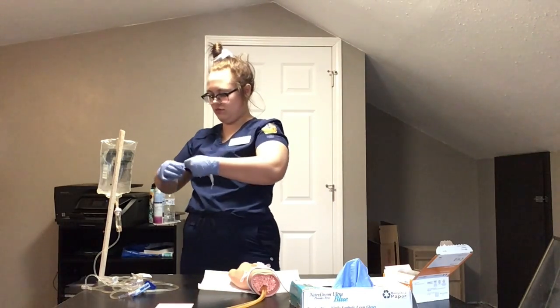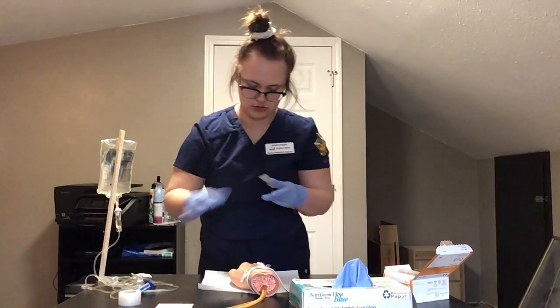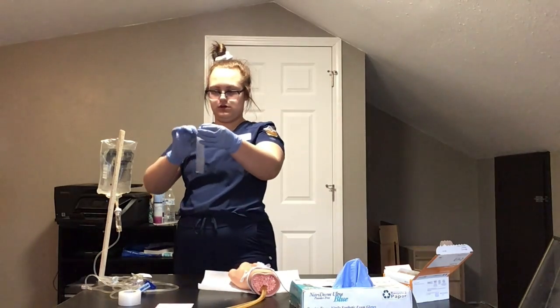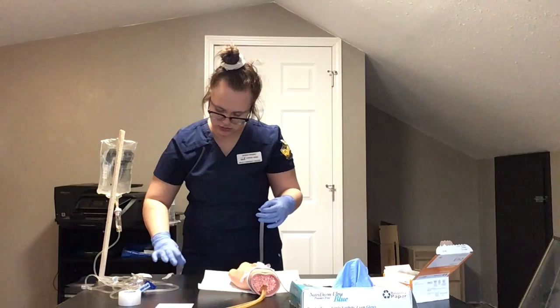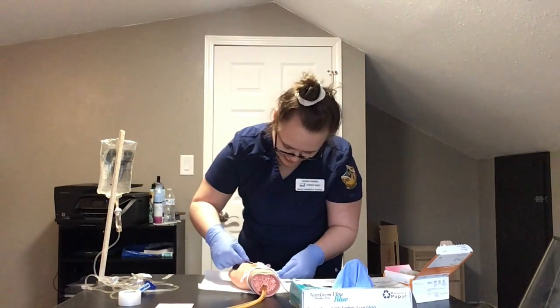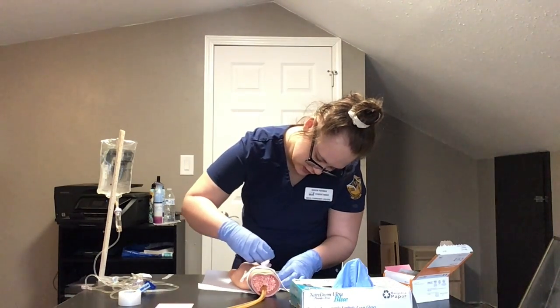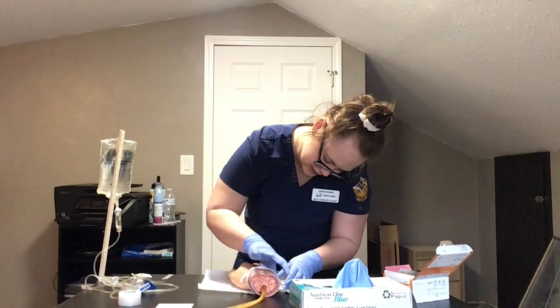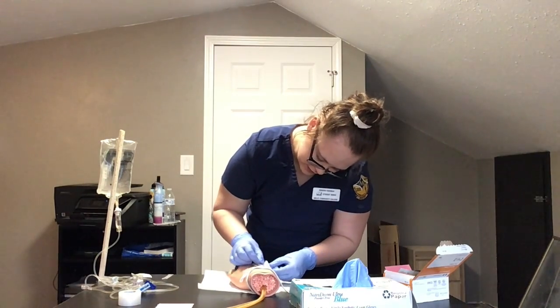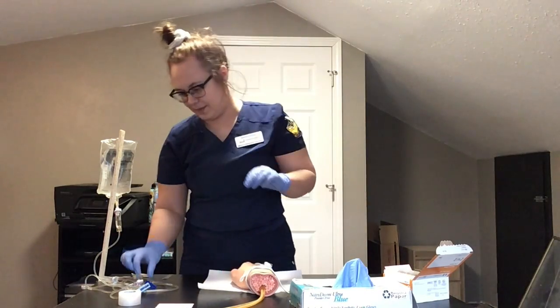That's way too long. Sticky side up. Place that under, and then I'm gonna twist it. And now that my IV is secure, I'm gonna get my tubing here.